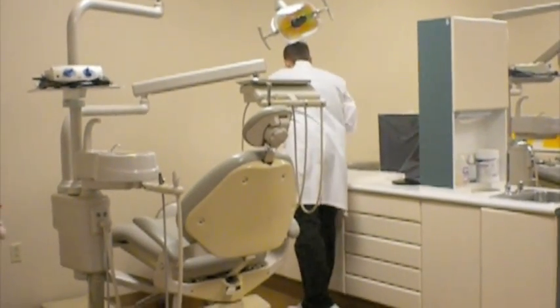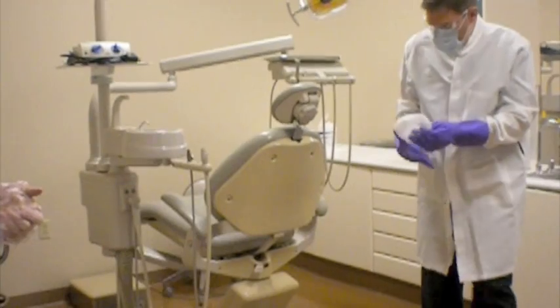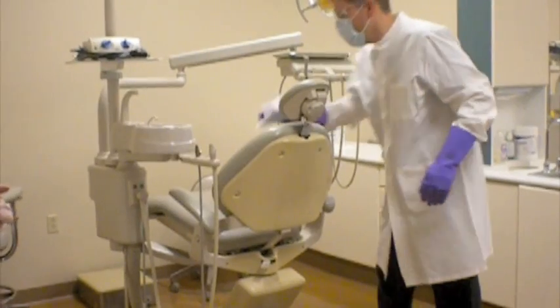Now what he's going to do is change his wipe because the one that he currently has is drying out or becoming soiled, and that's something that you want to look at. Is it soiled? Is it dry? And do I need to change it?